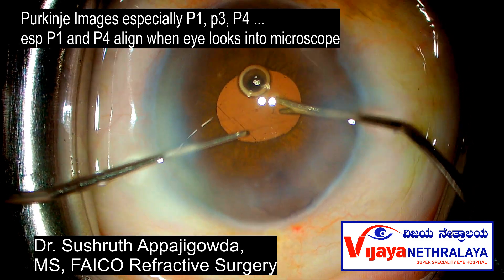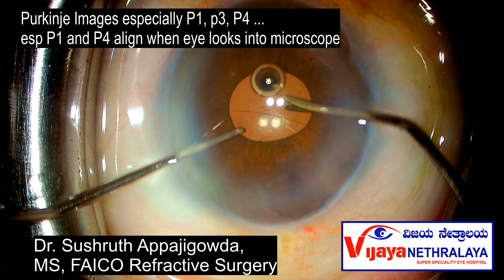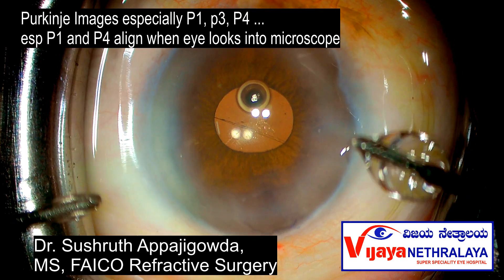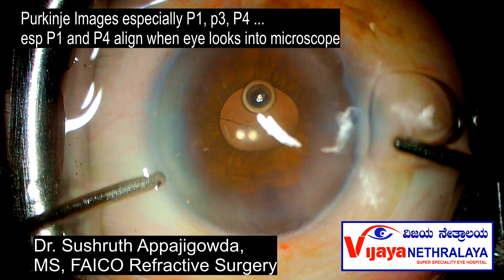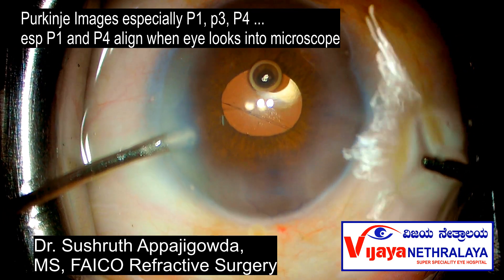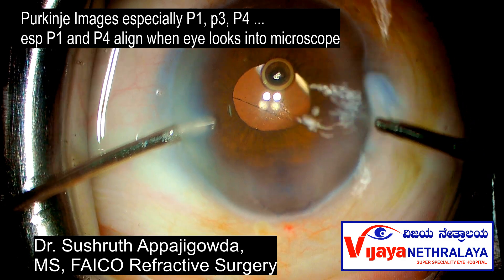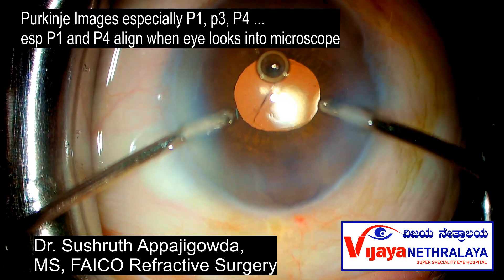Let's look at those Purkinje images now. That looks good — way better. The eye appears to be aligned and perpendicular to the microscope, and we can see all the Purkinje images. That's a beautiful sign.